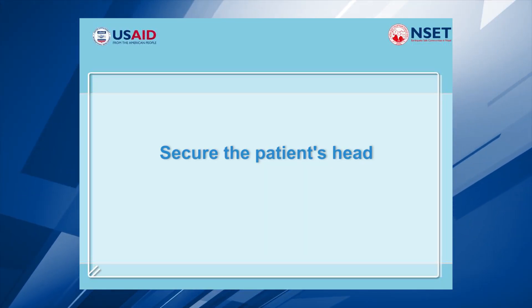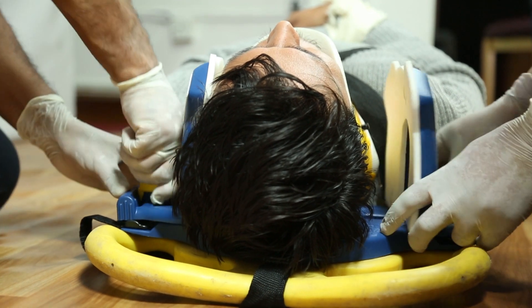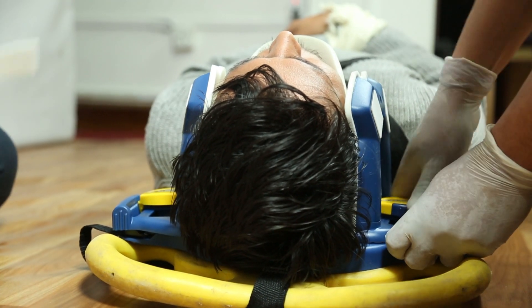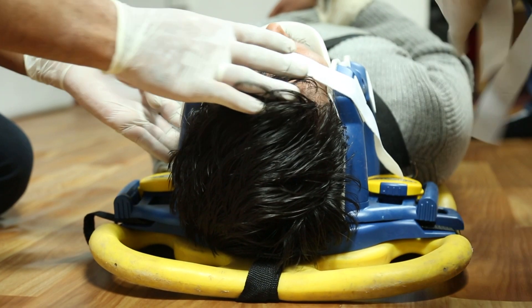Now secure the patient's head. Place a head roll on both sides of the patient's head on the backboard. Run 5 cm tape across the patient's forehead.